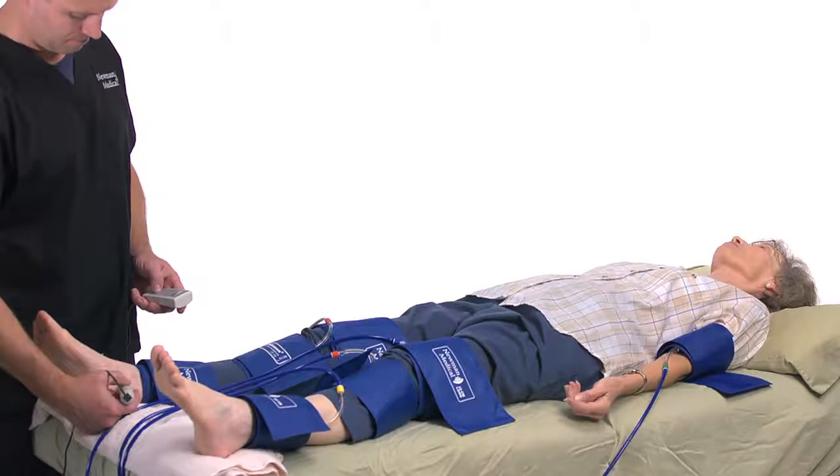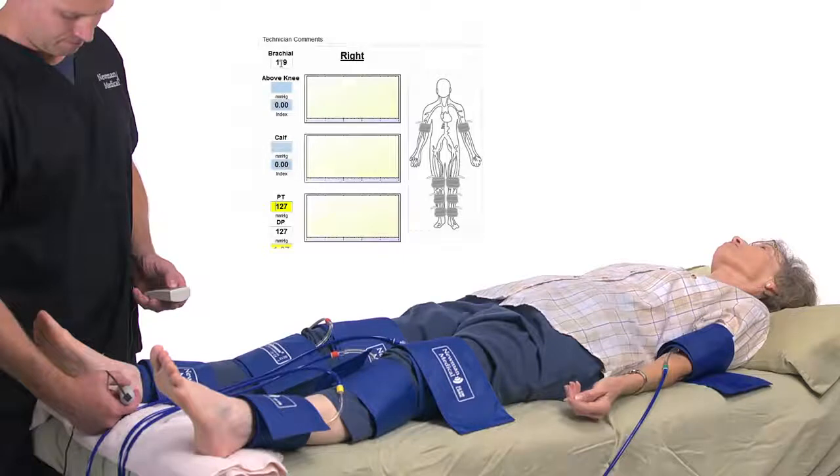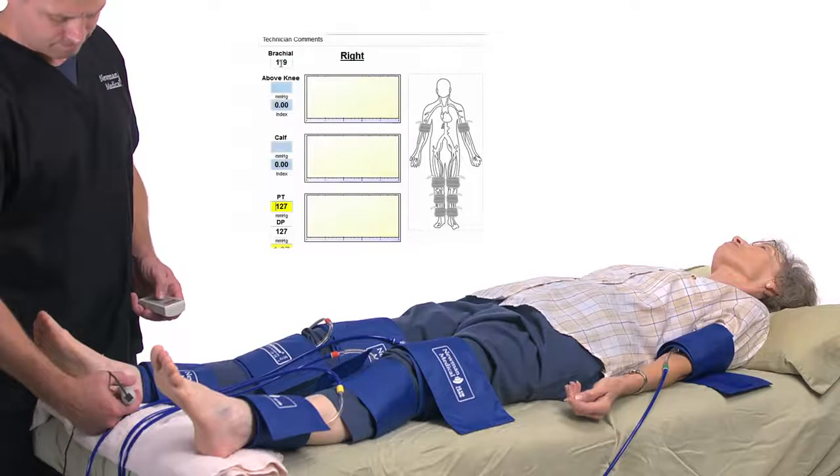Obtain a strong Doppler signal. Press and hold Inflate until blood flow occlusion plus 20 mm, release, and press Pressure when the sound returns, and the pressure will be entered in the PT field. Press Dump to prepare to take a PVR waveform.